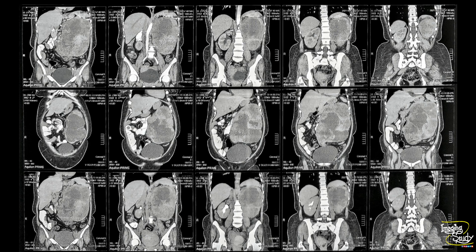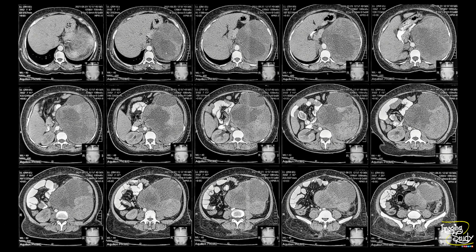We did a CT scan in this patient. The CT shows a grossly enlarged left kidney with dilatation of the pelvicalyceal system. You can still see the urinoma below the renal capsule having communication with the pelvicalyceal system. This is the axial image, and it is well observed on the coronal section as well.